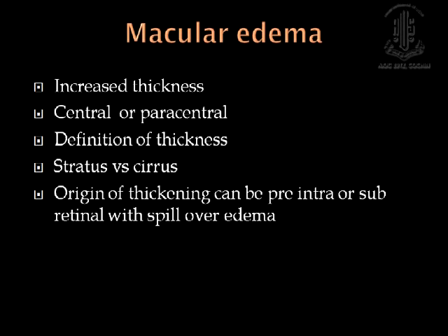The origin of this thickening can be various. It can be pre-retinal, intraretinal or subretinal with leakage, or there may be just spillover edema, as we shall see in the next slide.